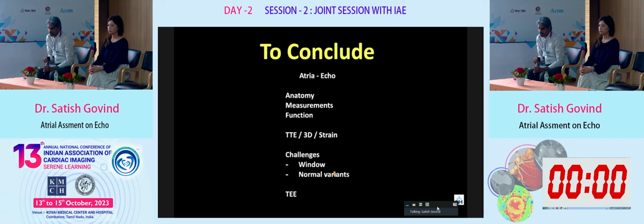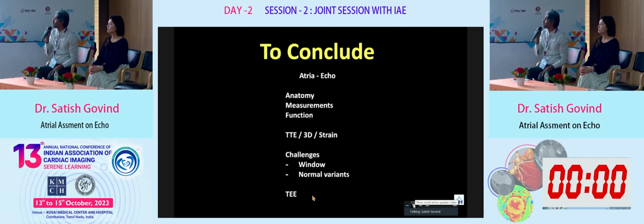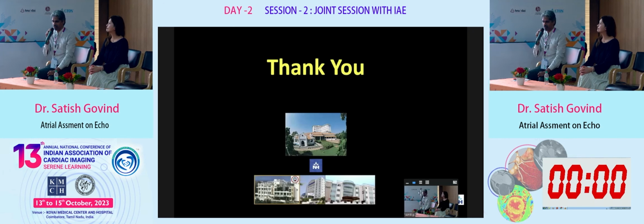Challenges, especially on the right side, are windows and normal variants. And of course, we are going to use TEE anytime there is a question that is unanswered or there is a dilemma. And beyond it, we are definitely going to seek your help. So thank you once again for your kind attention, and that is my presentation.